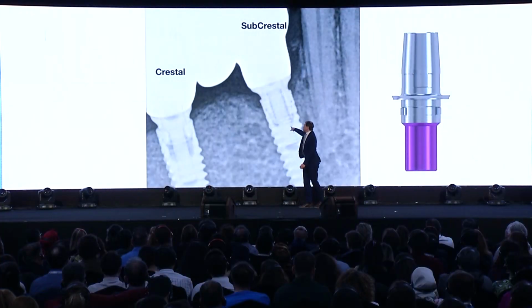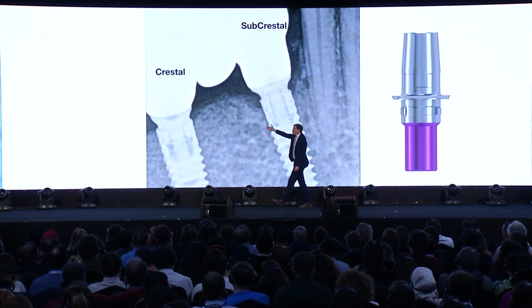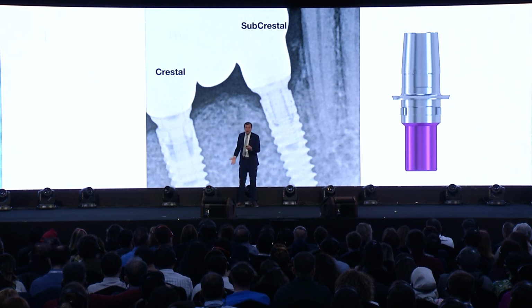How deep is my implant? Because for this implant, if I would just use a higher tie base, I would have no bone loss. But for this implant, a low tie base is as good, because the implant is placed at the level of the bone.